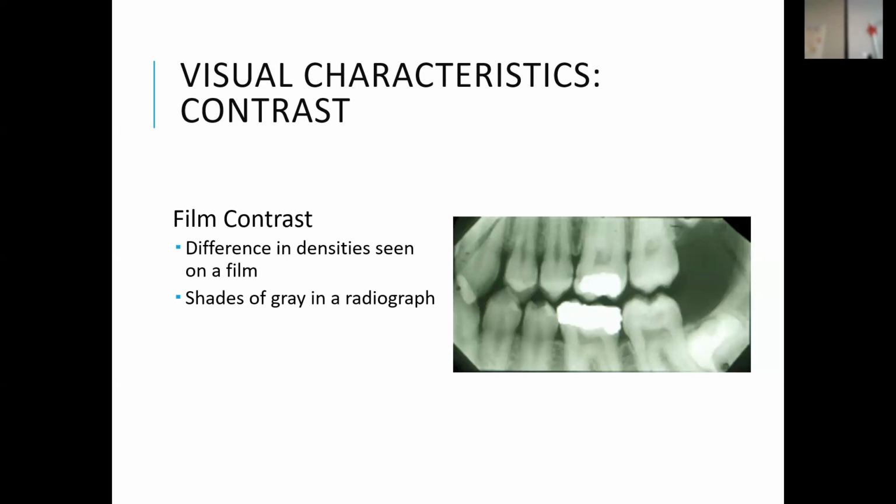So I think that's the whole concept, but we don't really use traditional film anymore, so it doesn't really matter, but it is kind of nice to understand the process anyways. Okay, so film contrast: the difference in density seen on the film.